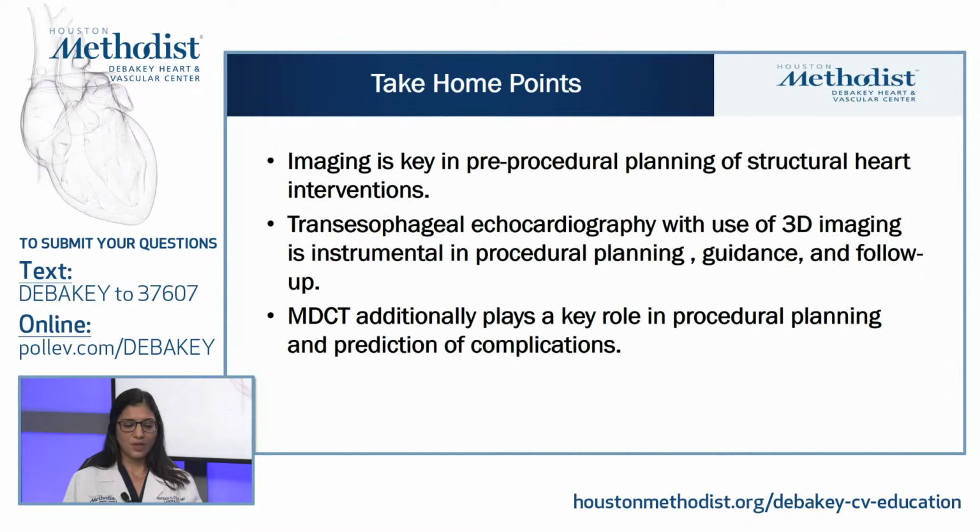So the take-home points from my talk are that imaging is key in pre-procedural planning of structural heart interventions. TEE with the use of 3D imaging is instrumental in procedural planning, guidance, and follow-up. And CT additionally plays a key role in procedural planning and prediction of complications.